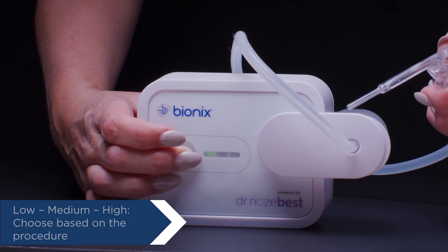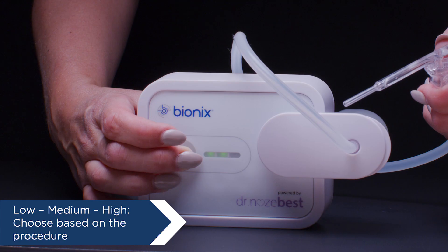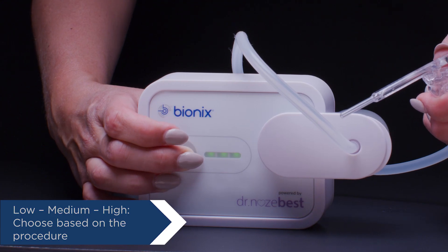Turn on the pump and select low, medium, or high suction, depending on the procedure. Select the suction level that matches your procedure.